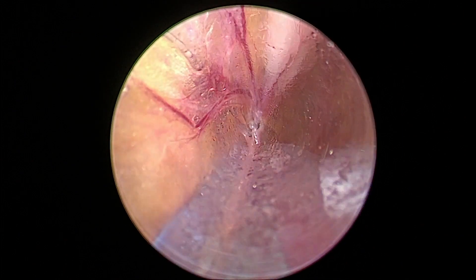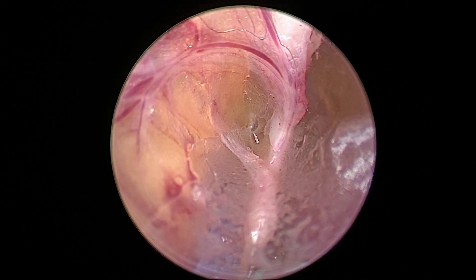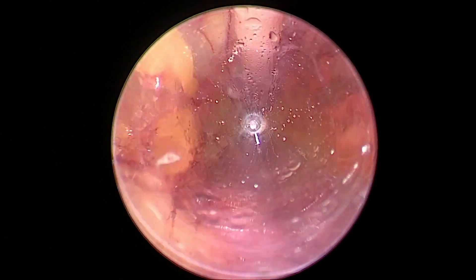Here I probably did more dissection than I had to, but I made a little window, moved forward, put the Pac-Man, pulled back, and you're ready to go. Good seal, no bleeding.